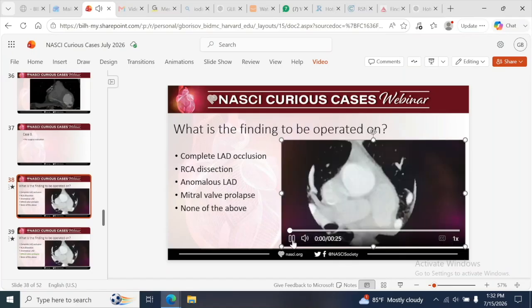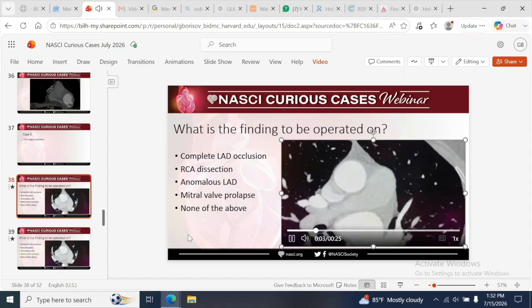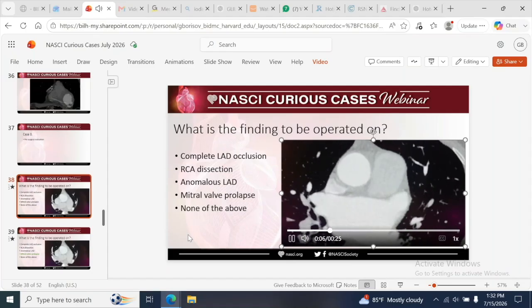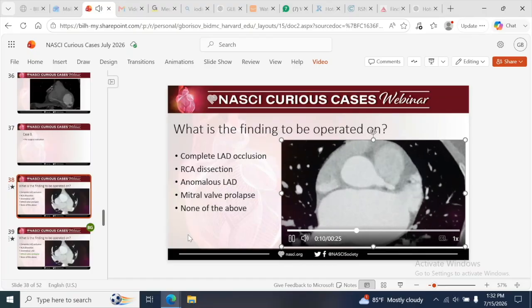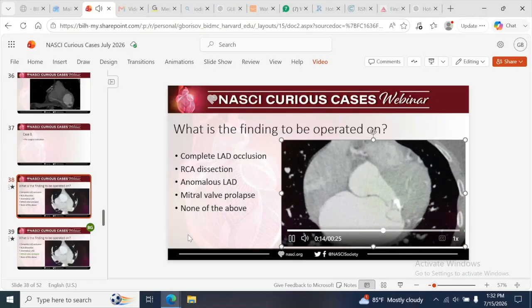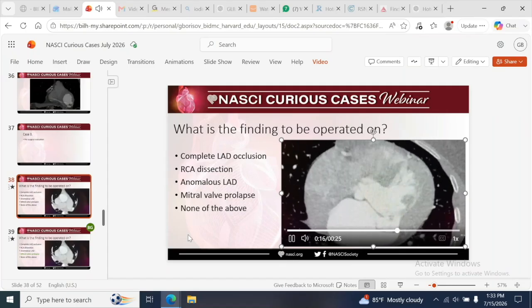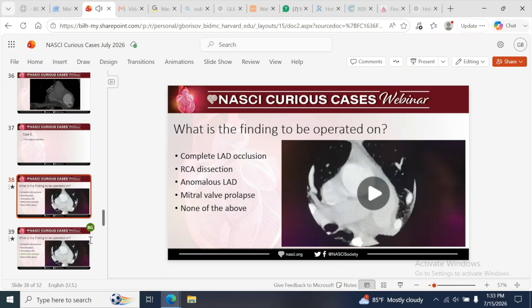Okay, I'm showing you again. So the salient finding is mitral valve prolapse, and I'm going to show you again on the video.